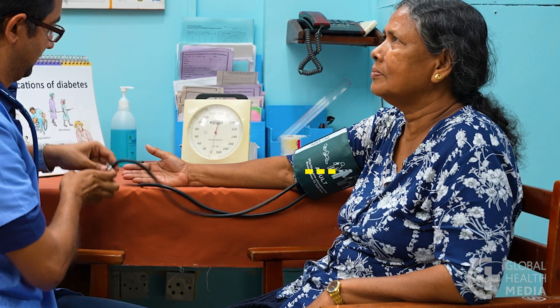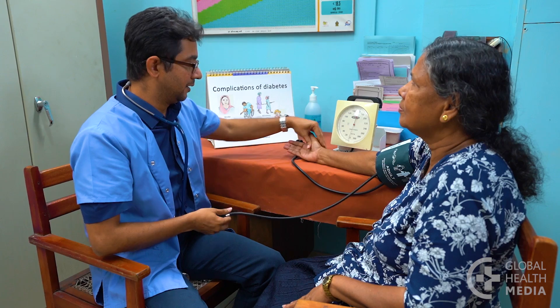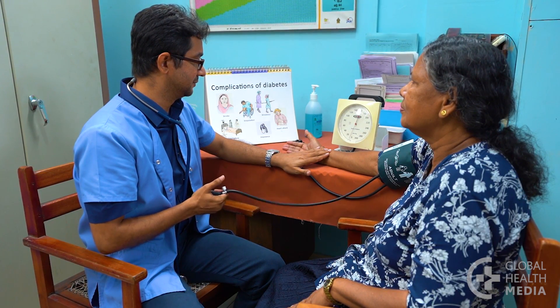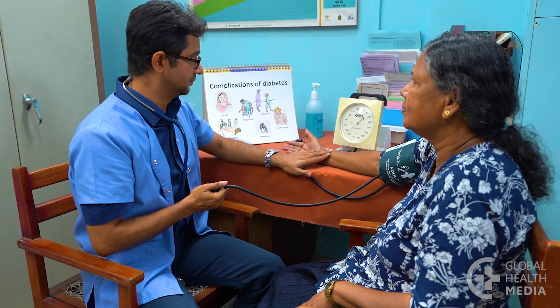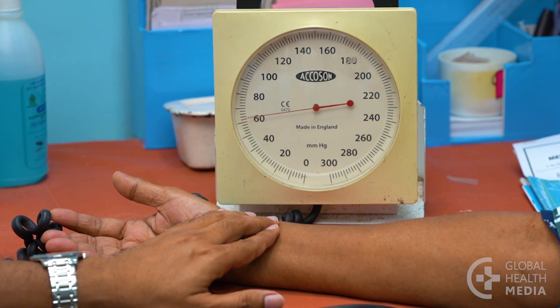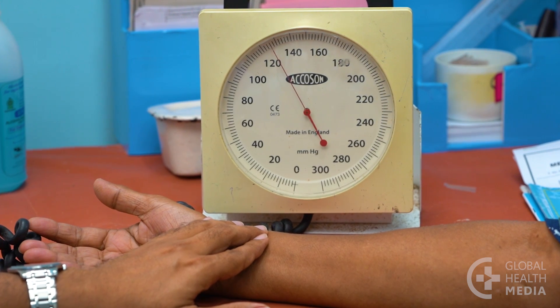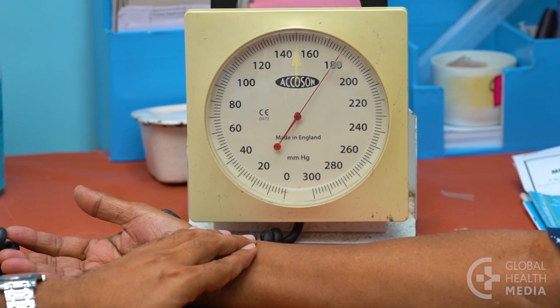The cuff should be at the level of the heart. To avoid over-inflating the cuff or underestimating the top number, feel the pulse as you inflate the cuff. At the point where you feel the pulse disappear, inflate the cuff another 30 points.